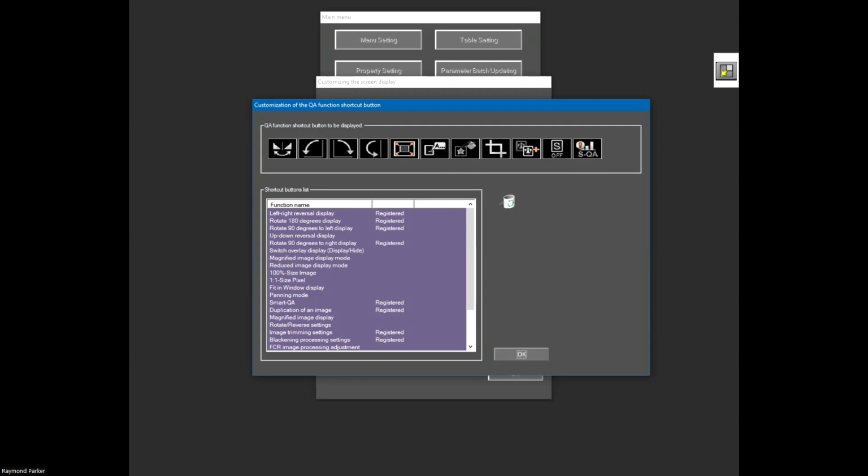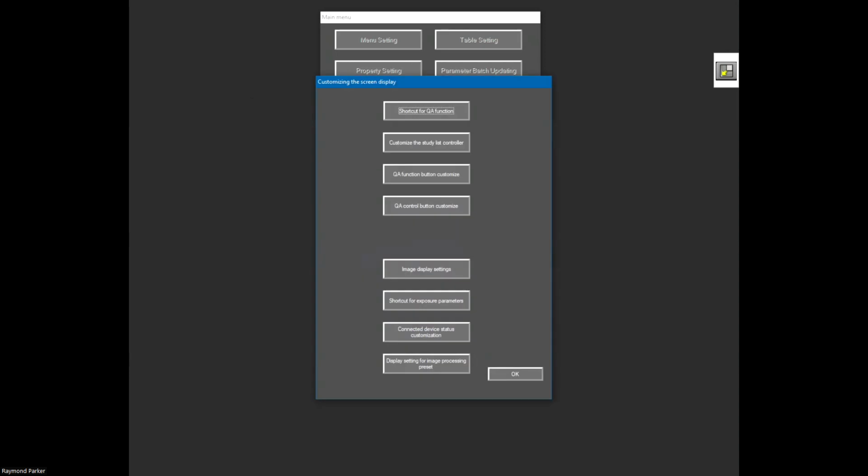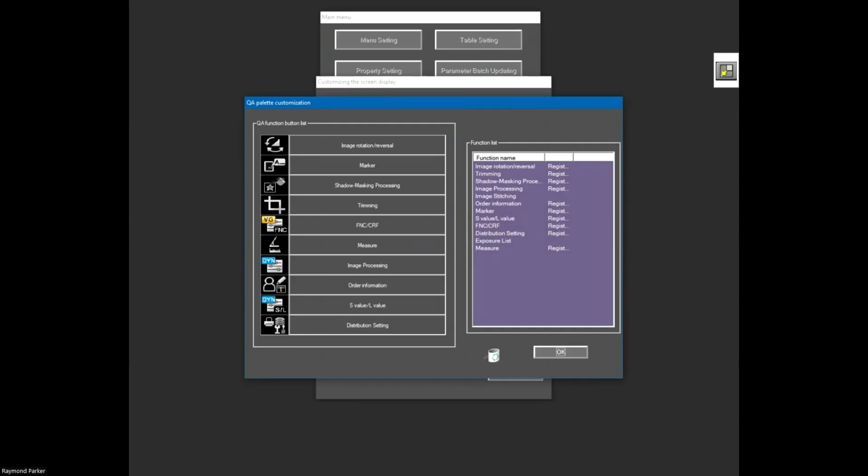Smart QA, that's where you would see your S number restrictions or your deviation index restrictions being available to the customer. The one I wanted to go to for the measurement function is your QA functions. If you notice, I have turned on the measurement function, and that is placed somewhere on the QA list here. I will review the QA function shortly with you guys and ladies, but that would be one of the functions for, especially on the portable.